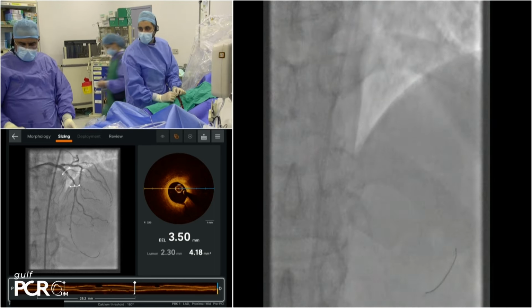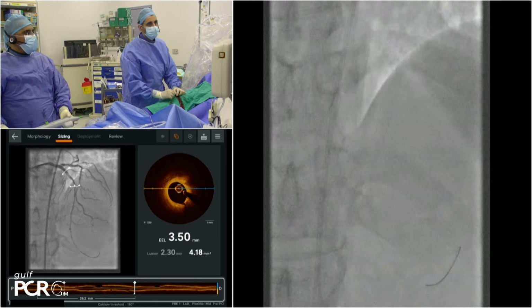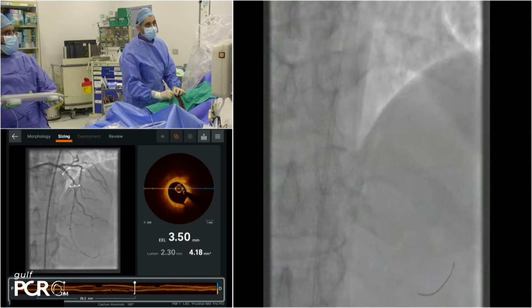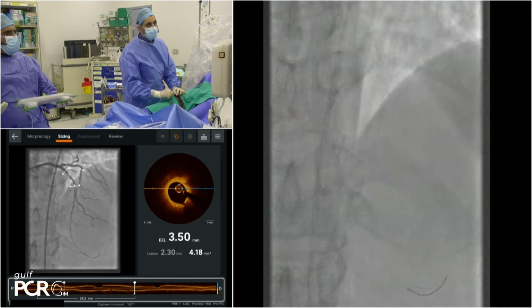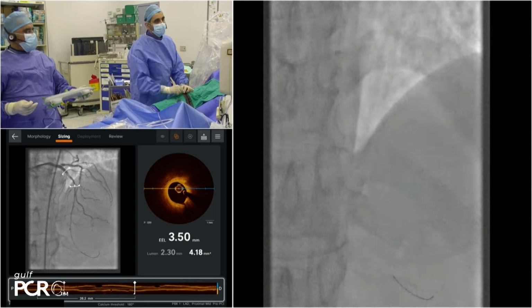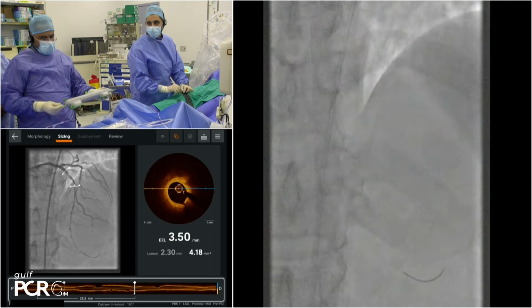Switch the wire, Basala. Turn it on. Go. The wire is just going. Go. Yeah. Watch the end of the wire, please. Okay, go. Stop, go.